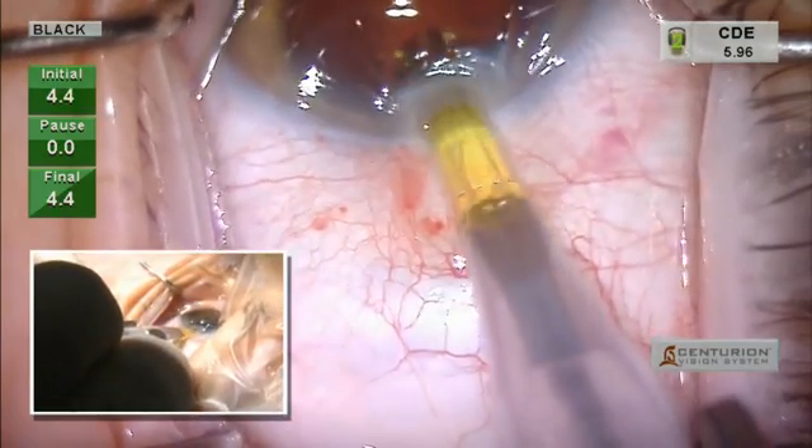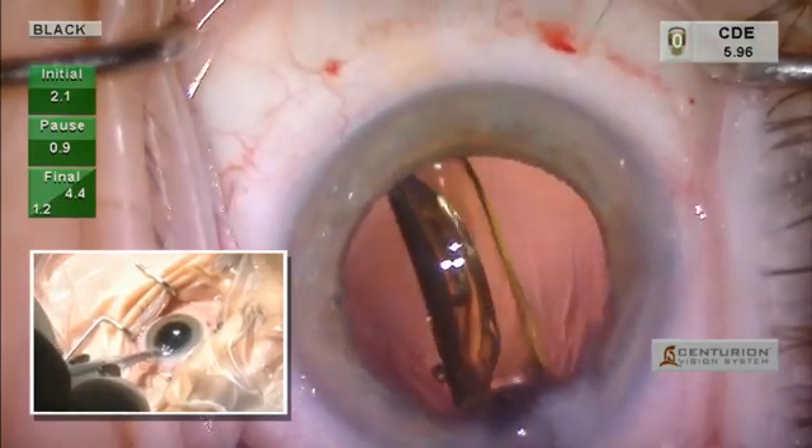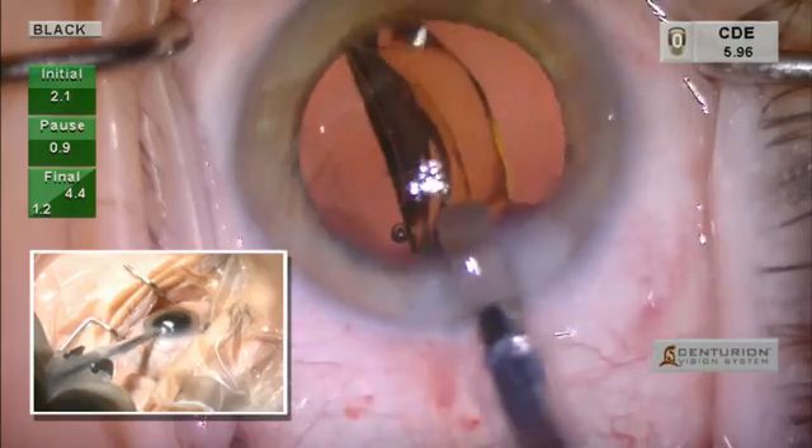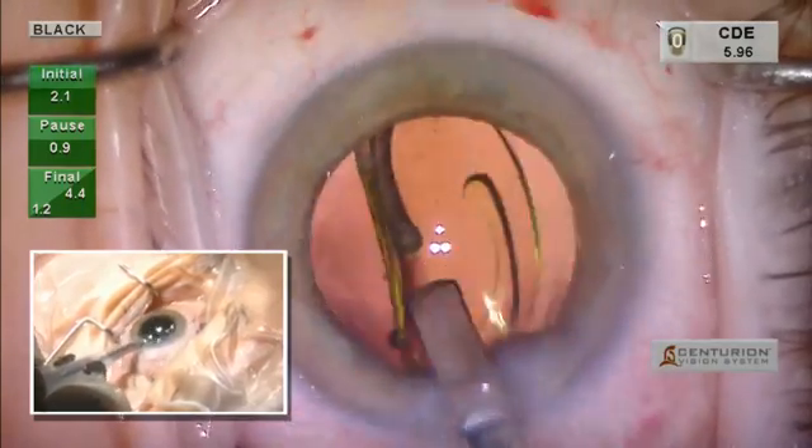This is the AutoCert injector. You can see how smoothly and consistently it injects the T7 lens. We then use the plunger to place the implant in the capsular bag.